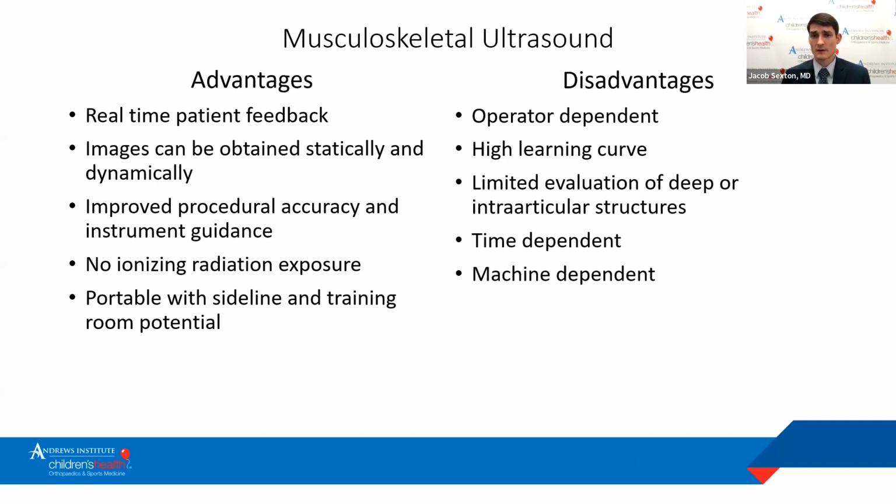The big disadvantage, though, is that it's operator dependent with a very high learning curve. It takes multiple years to become proficient in diagnostic ultrasound. And currently, I'm still in the phase where I'm learning something new every day in order to improve my skills both diagnostically and procedurally.